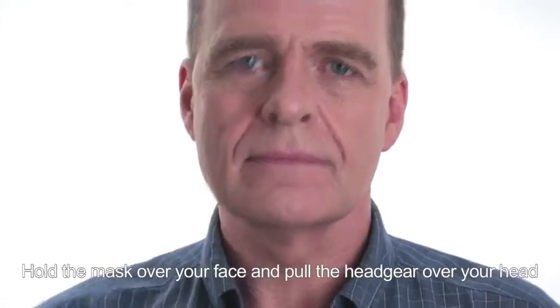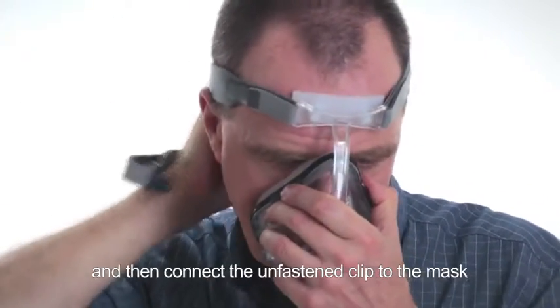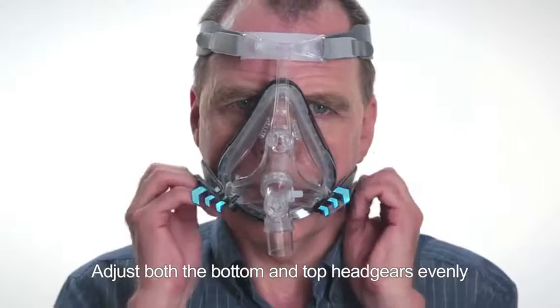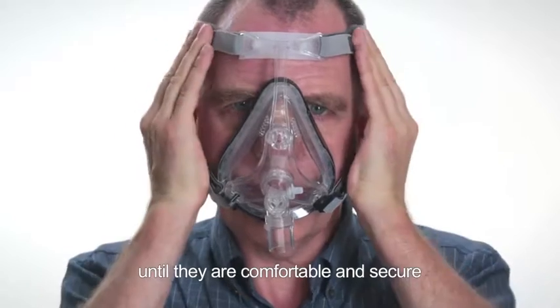Hold the mask over your face and pull the headgear over your head, then connect the unfastened clip to the mask. Adjust both the bottom and top headgears evenly until they are comfortable and secure.